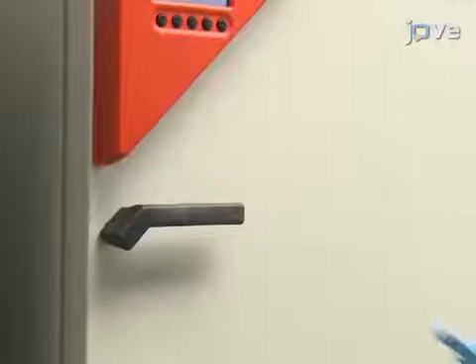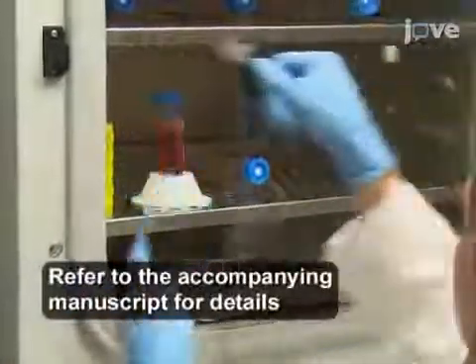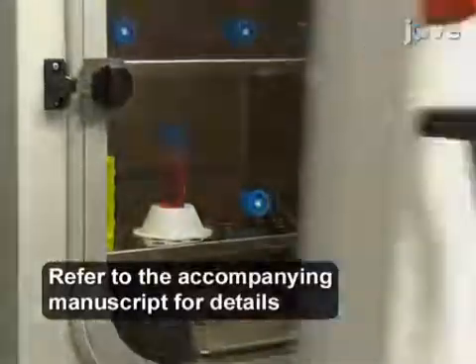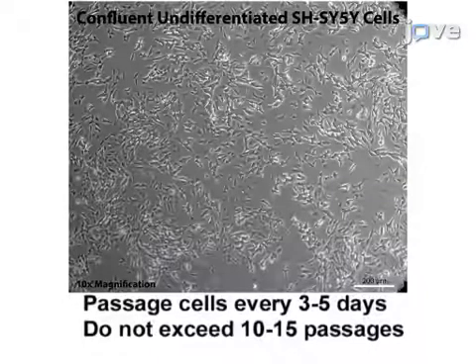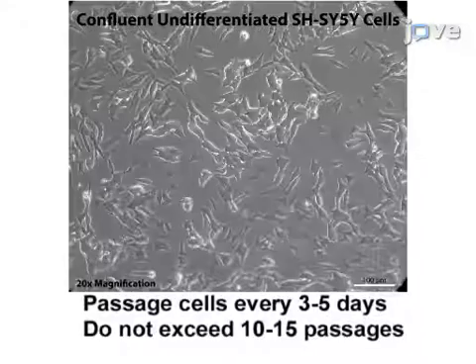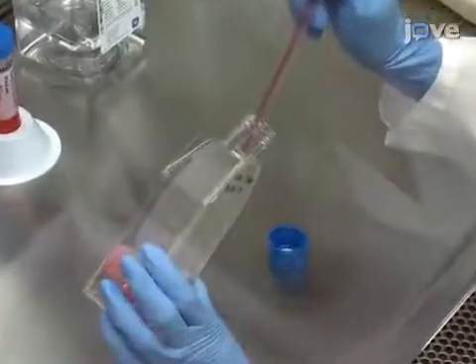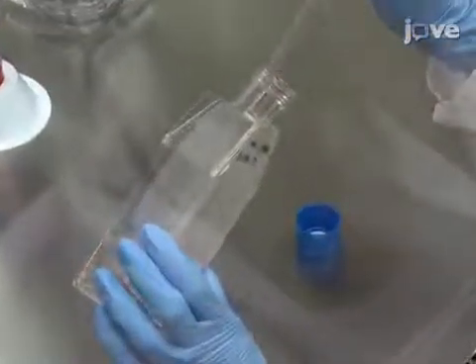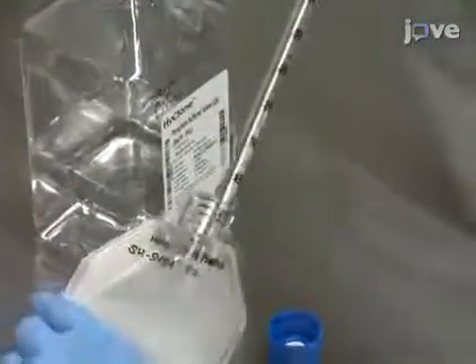To begin this procedure, allow the media to warm and equilibrate in the incubator in order to establish a proper pH balance before use. Then, split the cultures at the maintenance phase when the cells reach 70 to 80% confluency. To passage the cells from a T75 flask, aspirate off the media, then rinse the flask with 10 milliliters of 1x PBS.